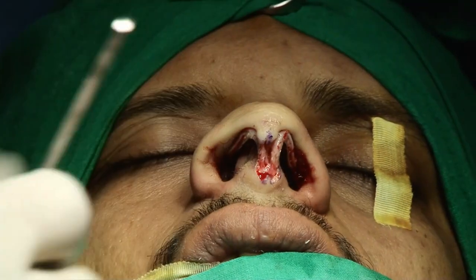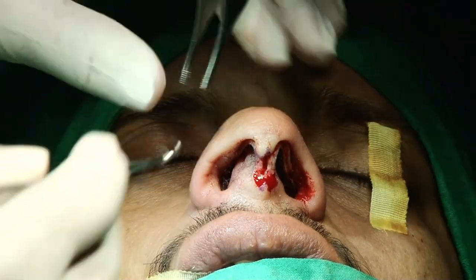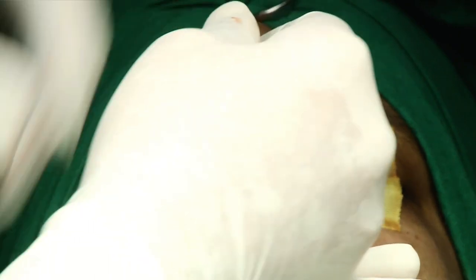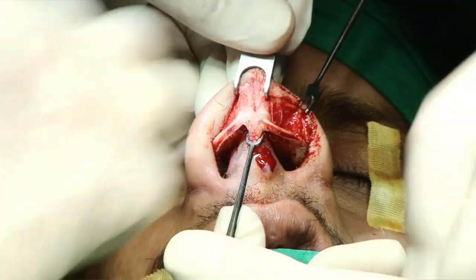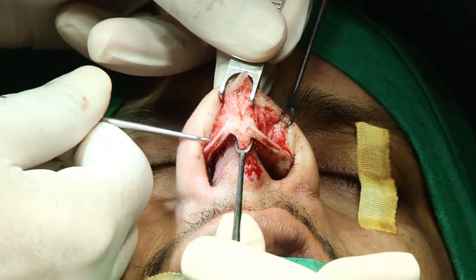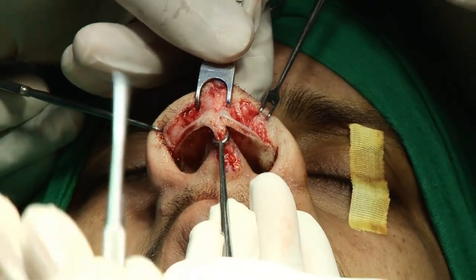So now the marginal incision and transcolumellar incision are finished, and then further I need this small double loop retractor, so I put it like this. This 3-point traction technique is classically important. This wide double prong retractor you place in the soft tissue envelope and give the counter pressure, and then take the middle. And give me the periosteum elevator. So now this is my periosteum elevator.